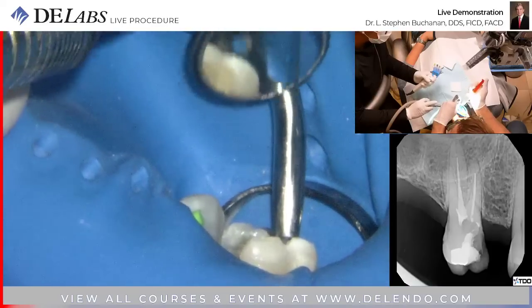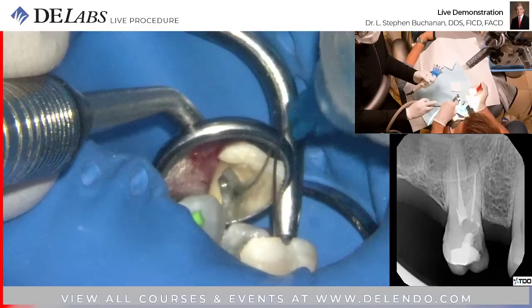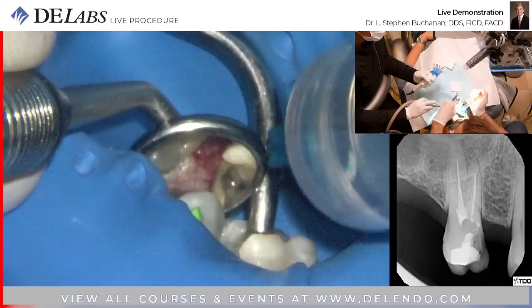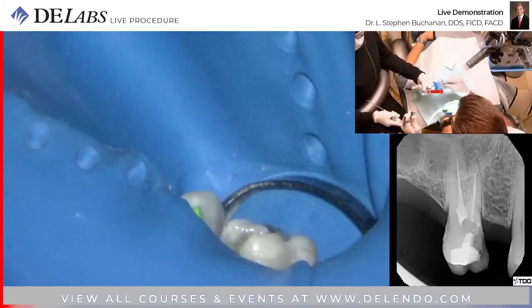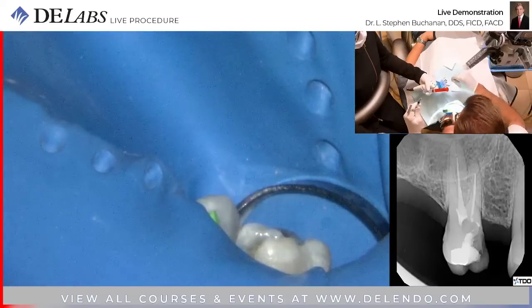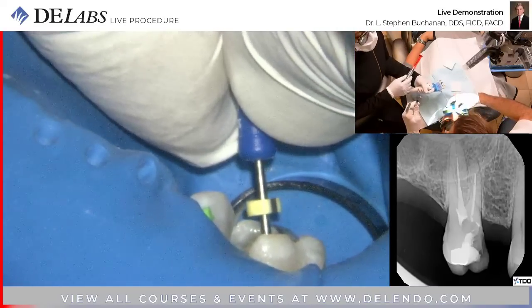Here's the distal buccal. Here's the 20, and we know it drops through. Here's the 30. Nice.